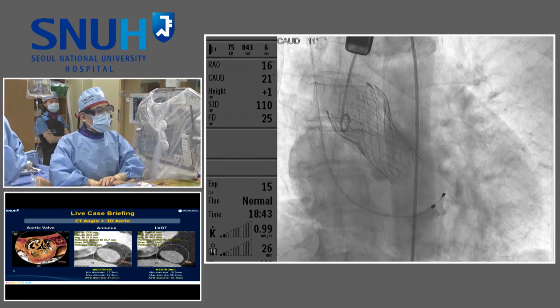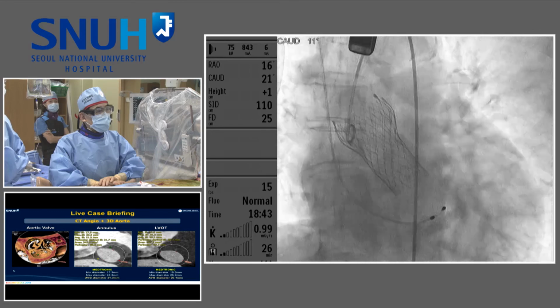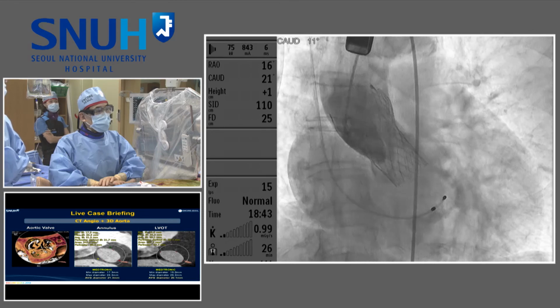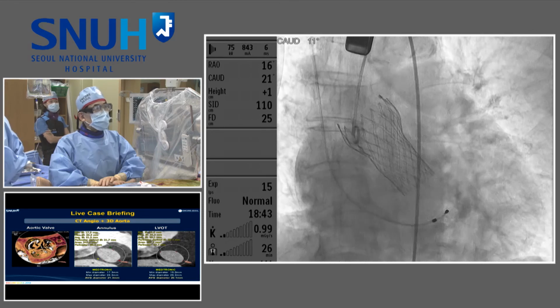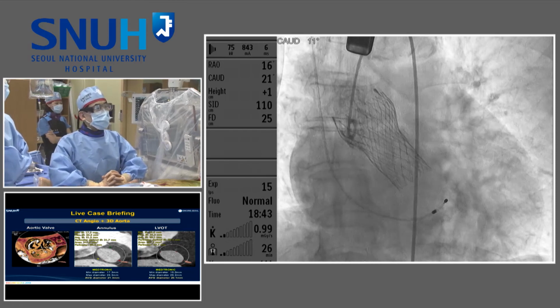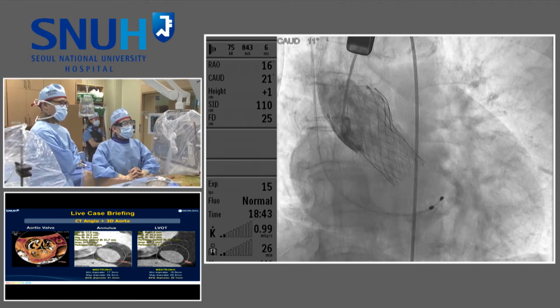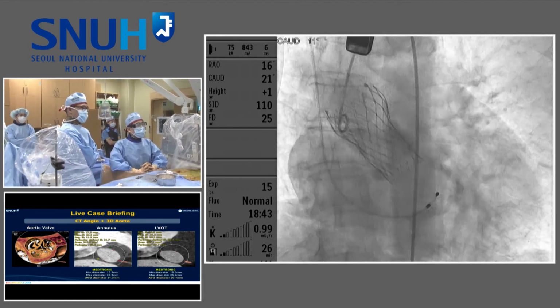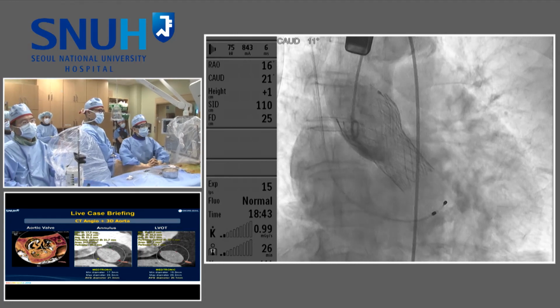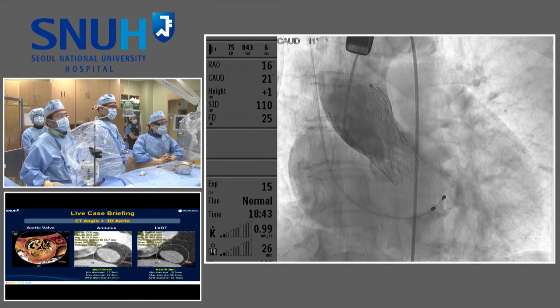Okay, I think we are all in agreement here that the results are beautiful. You should monitor the patient for the LBBB, of course, and this is something that is not completely understood worldwide. And you are going to close the artery now, and we're going to move to the next room.